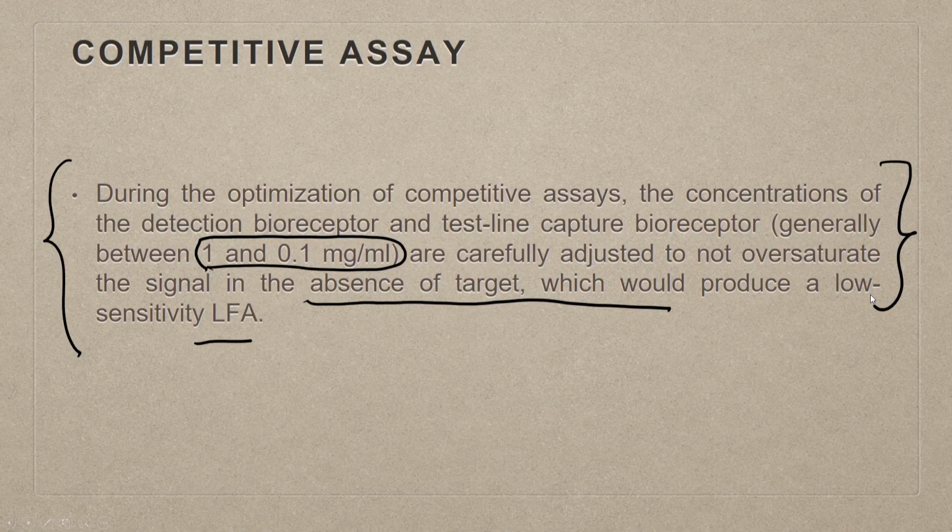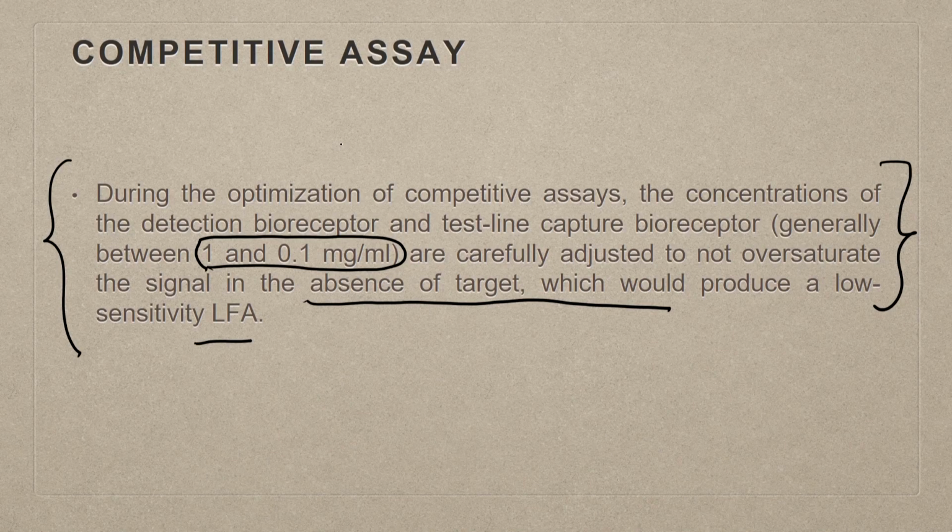So you have to realize that every system has a detection limit, and you cannot oversaturate the detection limits, because then you are going to get results which are ambiguous, which will confuse you. So you have to ensure that the binding concentration you are using should be within the permissible limits of the binding assays.